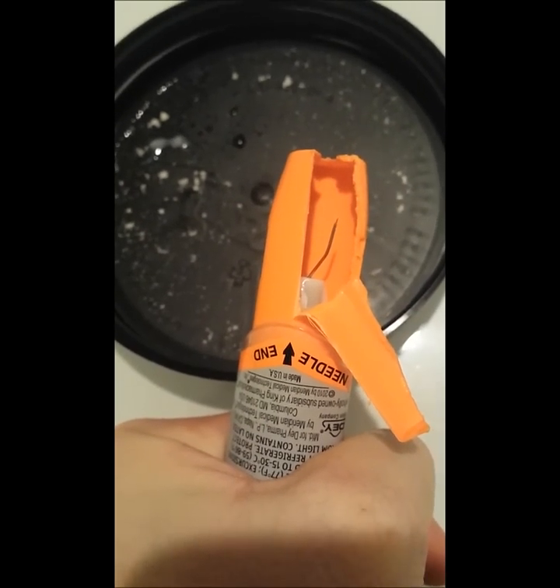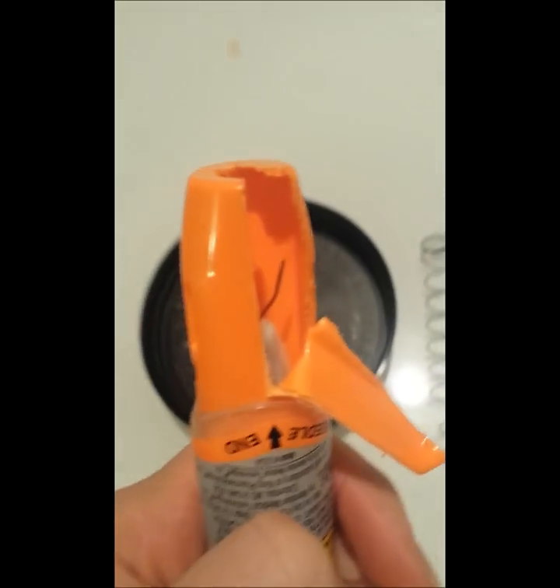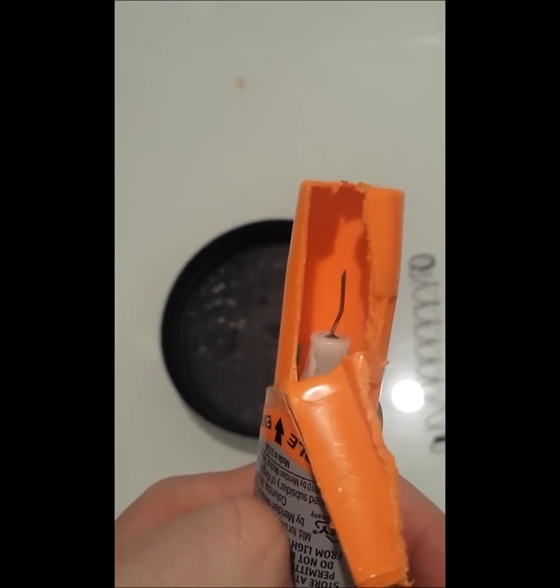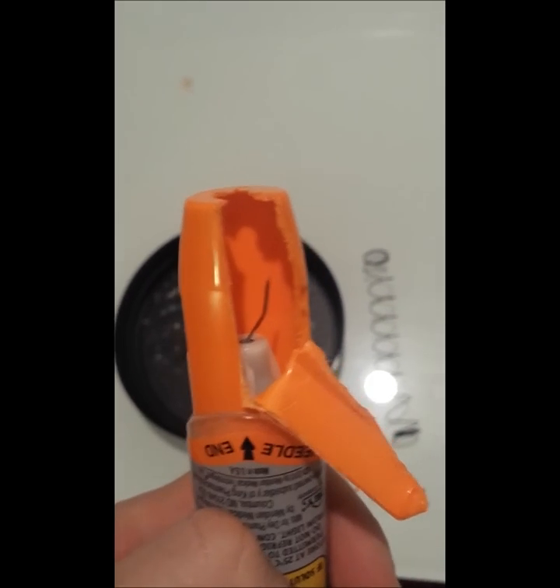I've had a lot of people ask how big is the needle, what does it look like, all that sort of thing. It's not crazy big or anything, but when you need it, you need it, and that's what it looks like.